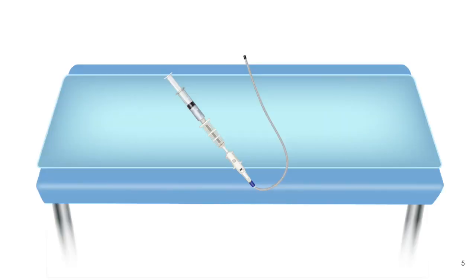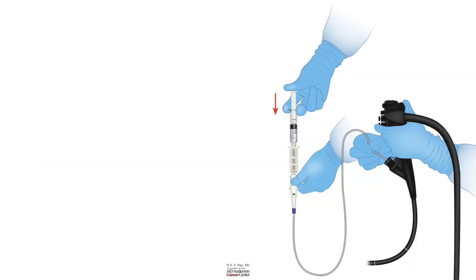Next, you take an injection catheter. We talked about how to use an injection catheter in a previous video. And let us talk about some do's about epinephrine injection, especially the precautions you need to take when you're using an injection catheter. Let's talk about the do's.